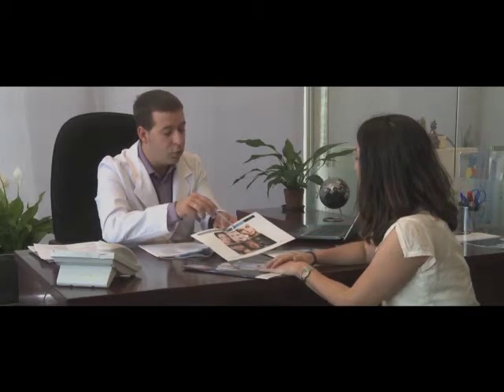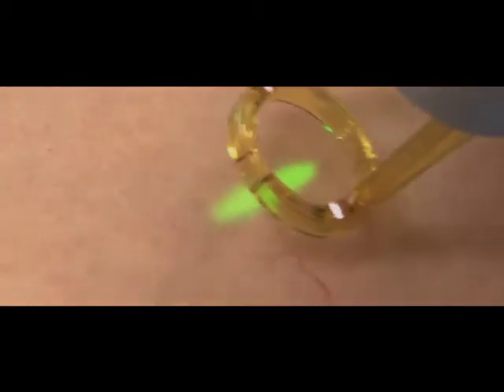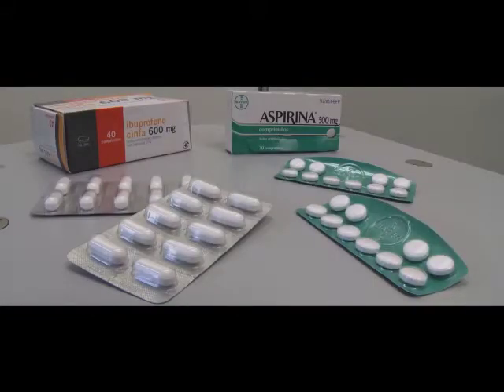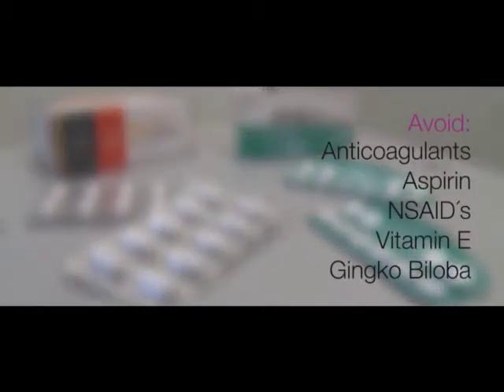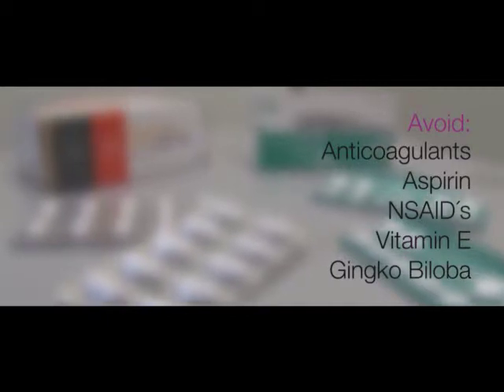Again, it is important to review the initial consultation portion of the video to make sure a thorough initial consultation is performed. In the case of vascular lesions, pay special attention to making sure there is no underlying venous insufficiency, which requires previous diagnosis by ultrasound. Also be certain that your patients are not taking medications that will cause bleeding or bruising, such as anticoagulants, aspirin, non-steroidal anti-inflammatories, vitamin E, or ginkgo biloba.